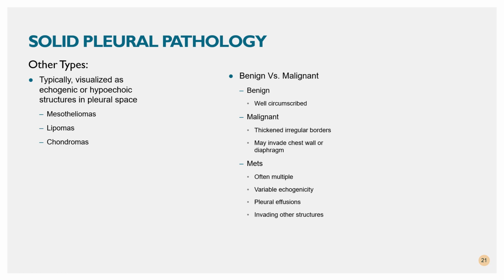So, we're pretty non-specific on certain pathologies, and that includes these of the pleural cavity. Now, there are some good ways to evaluate a mass and try and have an inkling whether it's benign or malignant. Most of our benign masses end up being very well circumscribed. They're slow growing. That's a good sign of it being benign.